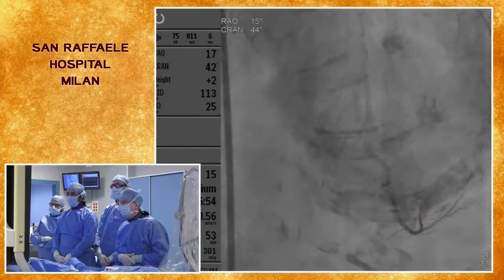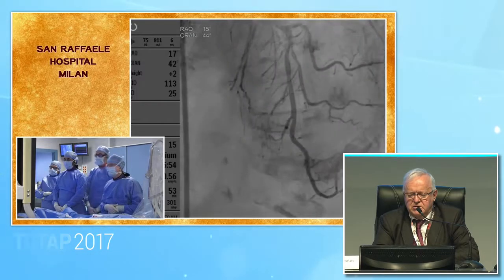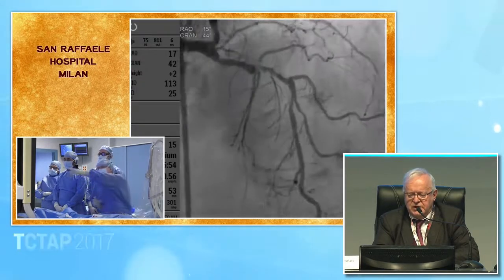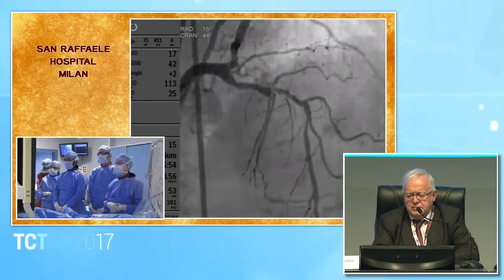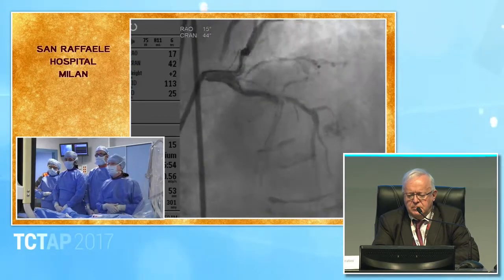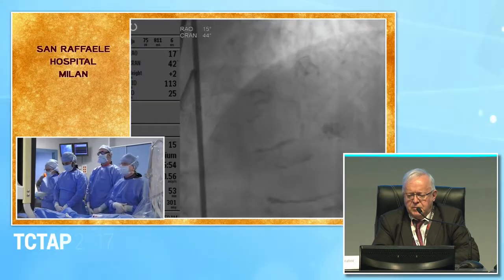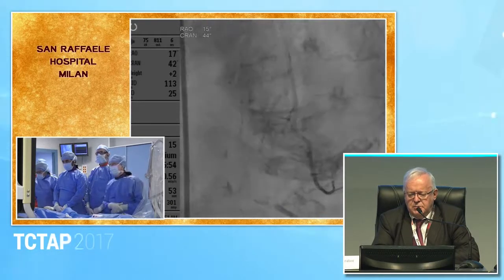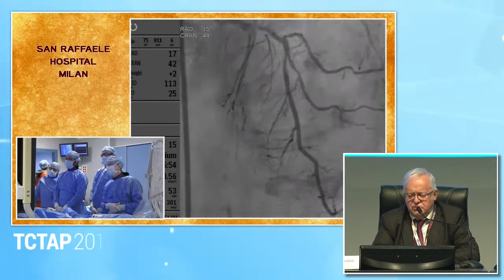I have a question for you. Distal diagonals. Do you have really to cover the proximal part of the LAD, or is it possible to stent immediately proximal to the diagonal, to the septal? No, I think in this view, I stop a little bit before the ostium, because it's very large, the proximal LAD. So I'm not going to go to the ostium. I'm going to stop where there is a very small diagonal. But personally, I will stop immediately before the second diagonal, not to go distal.